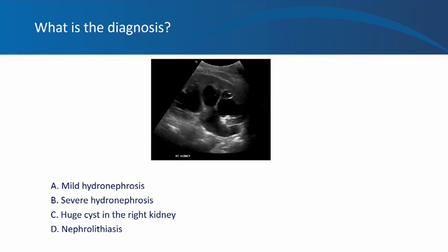Next question: this is a longitudinal view of the right kidney — is the diagnosis mild hydronephrosis, severe hydronephrosis, a huge cyst, or nephrolithiasis? No obvious stone with shadow is seen, making nephrolithiasis unlikely. A cyst inside the kidney would not cause renal pelvis and ureter dilation. Compared to previous images, there is far more urine backflow into the kidney with compression of the parenchyma — this is severe hydronephrosis.